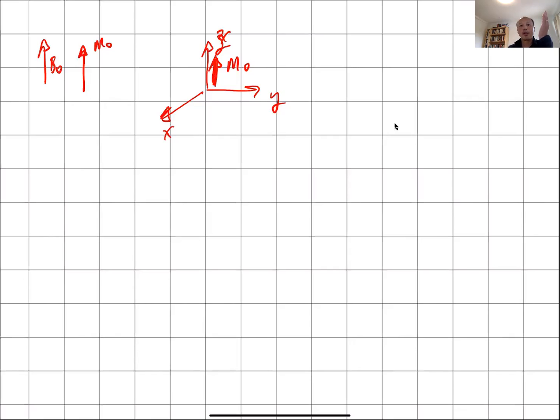One of the questions was what happens if you have theta equal 30 degrees. Let me see how the question is phrased. And the RF pulse, so remember there's a B1 pulse. We're applying a B1 pulse along the x-axis. And remember, precession always in MRI follows the left-hand rule. If you want to know which way things are going to precess, you point your thumb in the direction of the main field, or whatever B field you care about, and then the direction of your fingers tells you which way it's going to precess.